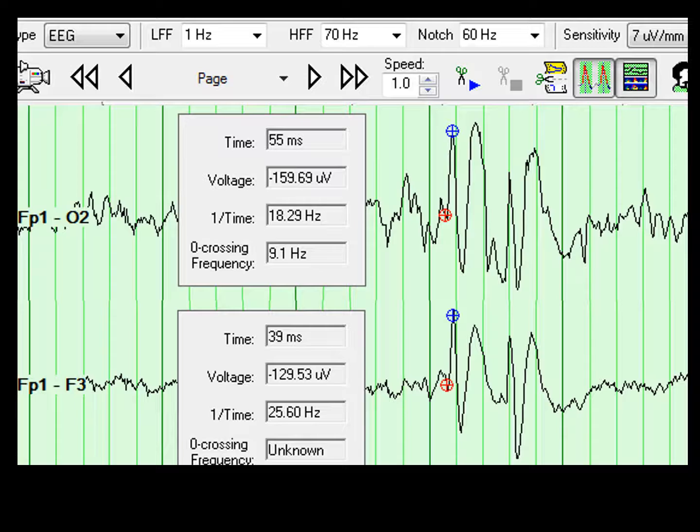The reason is that the tissue between the generator and the recording electrode behaves like a fast frequency filter, thus decreasing the amplitude of the fast wave more than the amplitude of the slow wave as the distance increases. A fact that is expressed in this tracing by the slow wave catching up to the fast wave as the distance between the two derivations is increased. I will come back to this issue shortly. I will do so to explain to you why, despite the high frequency filter effect of tissue, the fast wave has a higher amplitude in the longer distance derivation than in the shorter distance derivation.